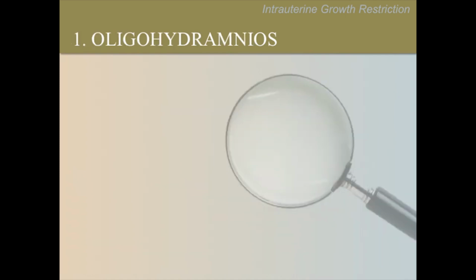Now let's review our previous lecture. Please ask a volunteer to recall what we might observe on ultrasound with oligohydramnios. Which 2 methods might we use to verify oligohydramnios, and when should we use each method? Please pause the video now to discuss.